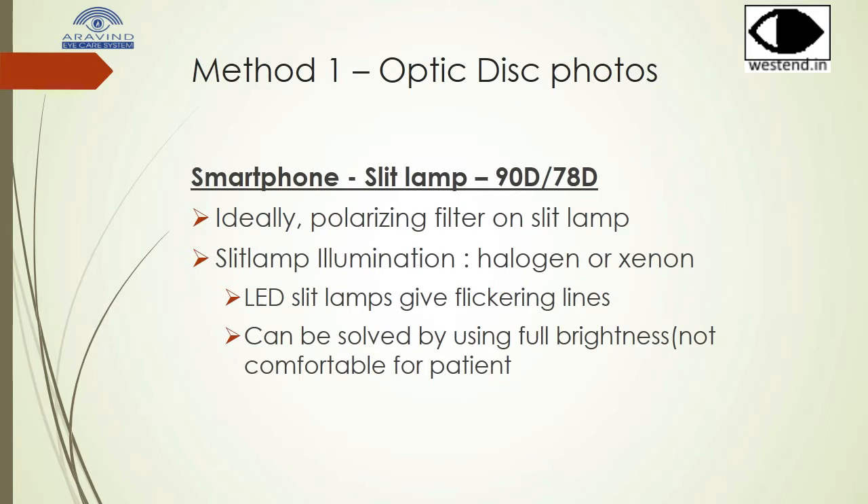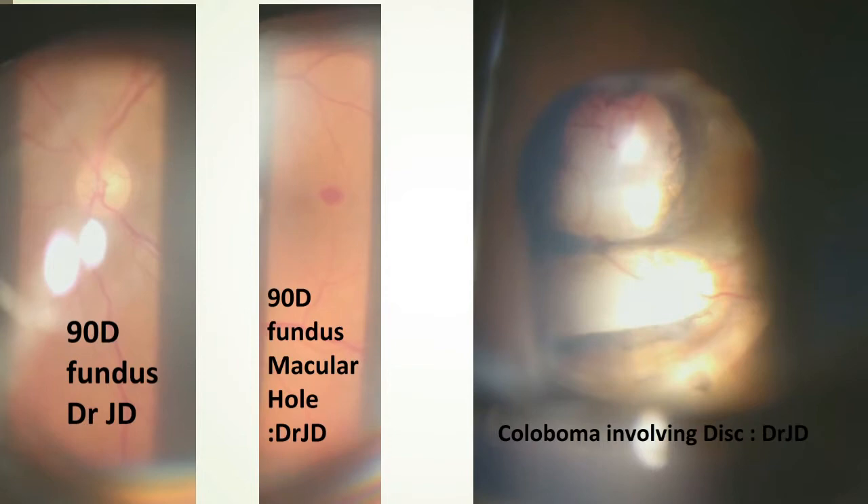LED slit lamps give a flickering light unless they are at maximum brightness. This image shows a fundus which is essentially normal. This shows a macular hole, and this shows a coloboma involving the disc. All were taken with the same method: a 90 diopter lens on a slit lamp.